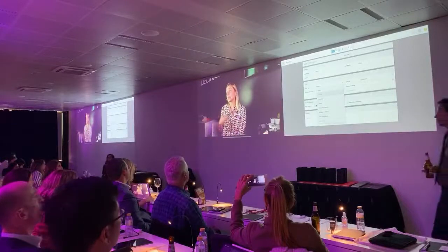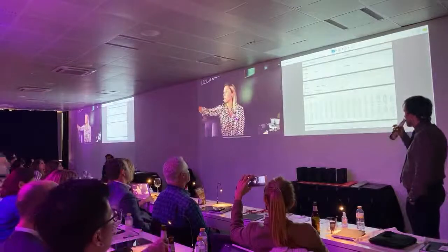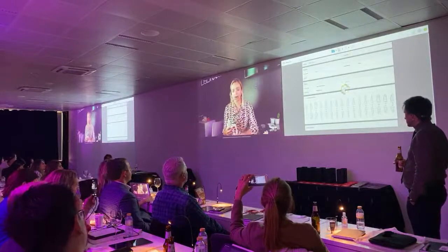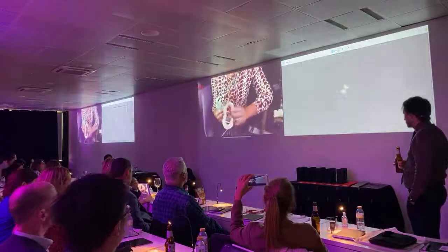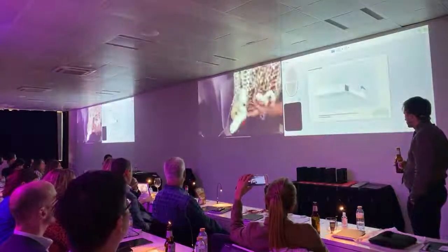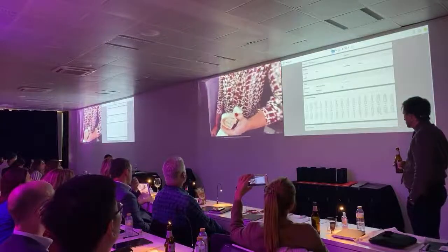In our case, we choose for chair-side milling solution, and then we go to scan. This was the case of our last residency, who were there will know. So the first thing that I do is to scan the arch. Oh, let's go back 1 minute, I forgot here.